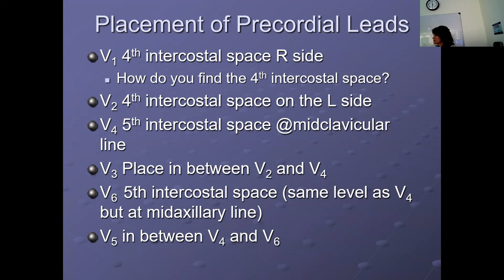What is it? The body? What is the top part called? Excellent. No, that's the bottom. Manubrium, body, and xiphoid, right? Yeah. So between the manubrium and the body of the sternum, the bone sticks out, and that tells you where the second rib is. So if you feel over to the right side, you're going to feel a rib right there, and that's your second rib. Then below that is the second intercostal space, and then your third rib, below that intercostal space, and then your fourth rib. And that's where you would put your first lead for the chest, is on the fourth intercostal space.